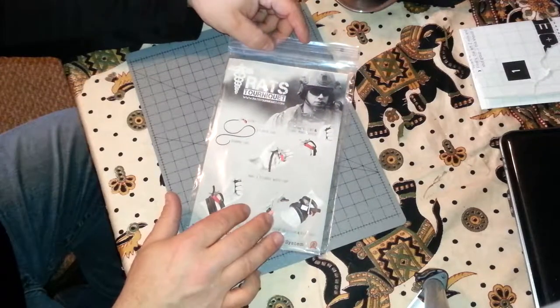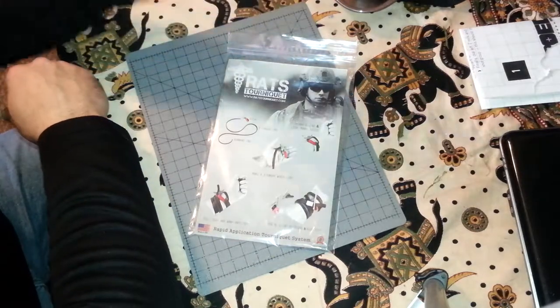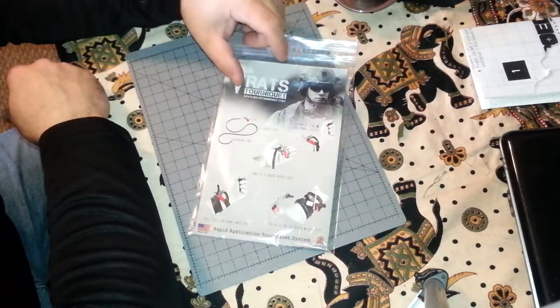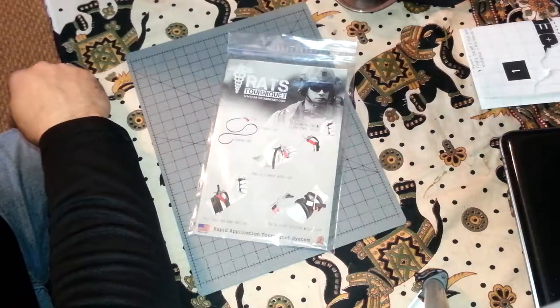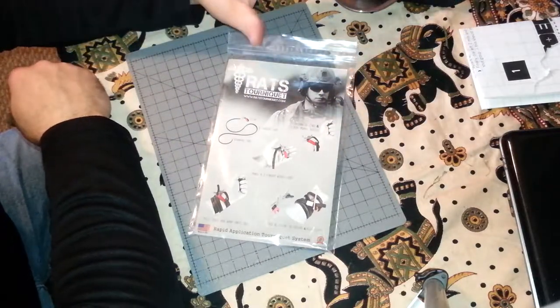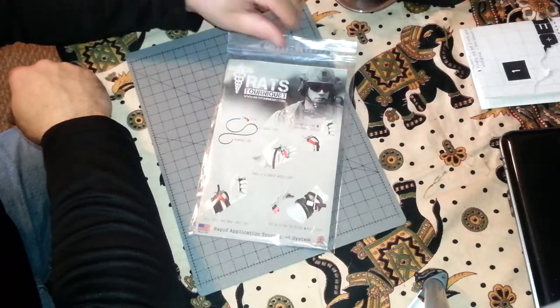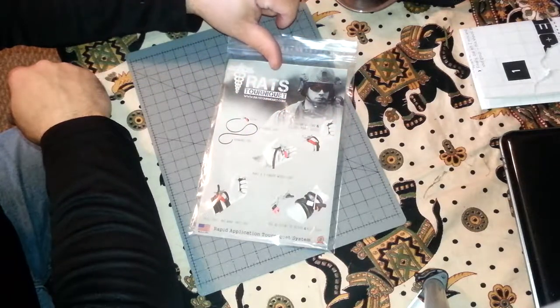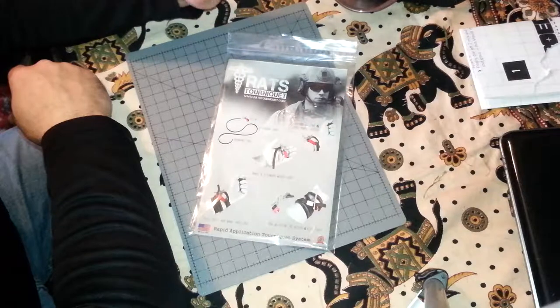There are people that complain this is not a good one — you need the SOF-T or the SWAT or whatever with the two-inch or one-inch strap. I've argued with people about that even though I hadn't used it yet. But from looking at it, this looks like the way to go.